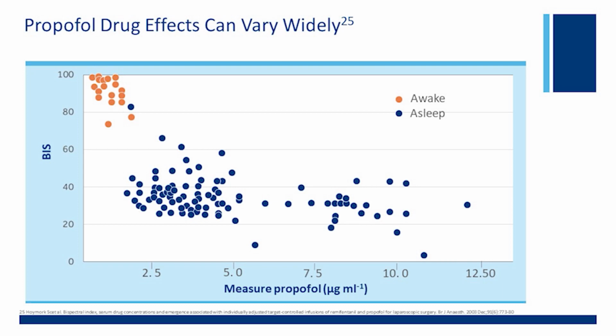So that gives you the level of confidence that if you are going to use brain monitoring such as bispectral index, let's say I have a patient under anesthesia and I'm using bispectral index, if that number goes above 70, I am concerned that the patient may have awareness. So I typically very quickly give a bolus of propofol, trying to bring the BIS level down to below 70, because statistically, if the BIS is below 70, the chance of awareness is extremely, extremely low. So you want to keep the anesthetic below the BIS of 70 if you are intending a general anesthetic.